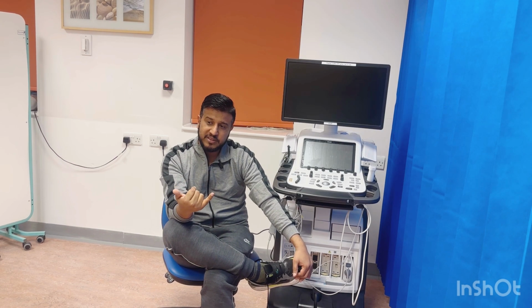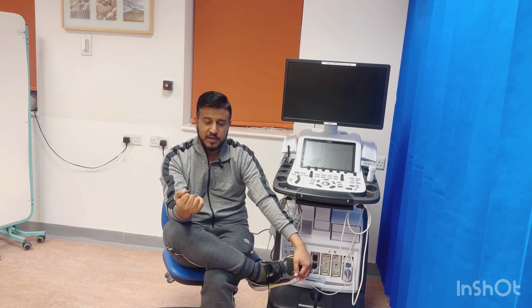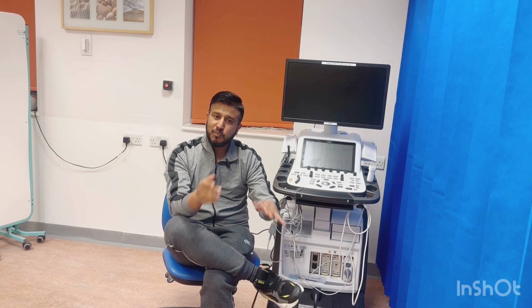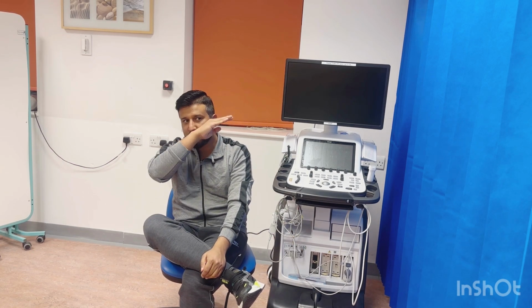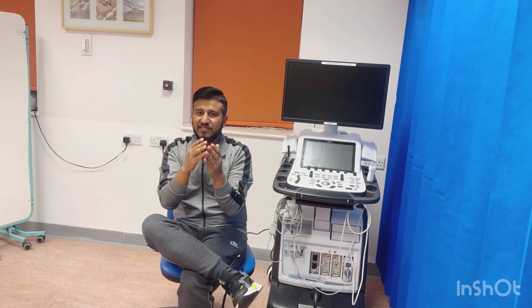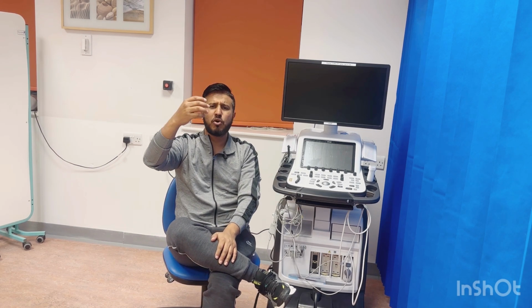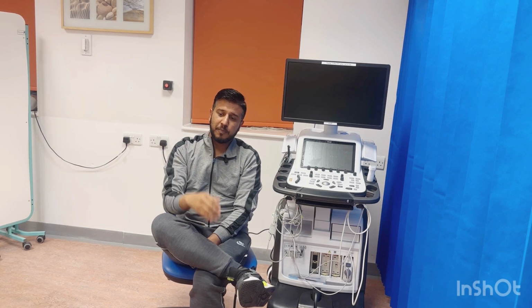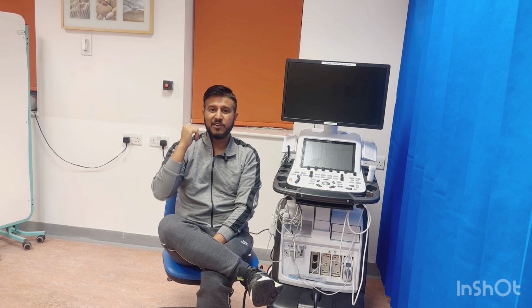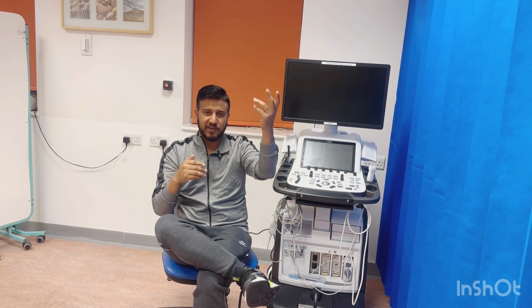Another very important thing, I wish I had examples, but I don't, I'll show you next time if I get one. When we put the Doppler on the aortic valve, sometimes we get a very good signal, but actually that signal is not correct, because if we see the peak velocity, it is around 2 or maximum 2.5, which doesn't make sense, because the aortic and LV pressures are quite different, unless the LV pressures are significantly high.